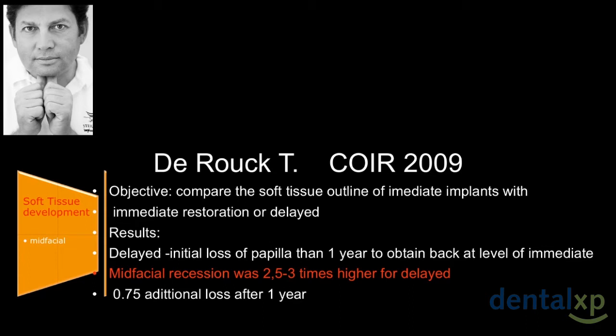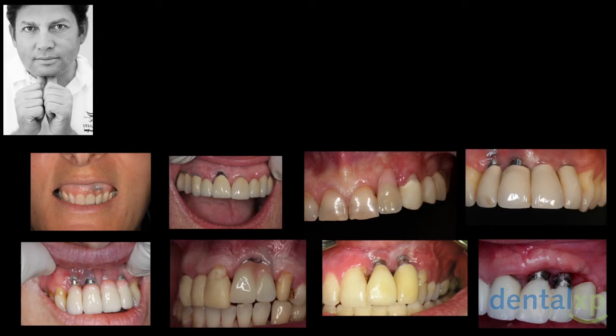So we developed an algorithm for developing these soft tissue techniques. Now, this is what we want to avoid. When we want to restore or repair these cases, how do we know if this is a surgical problem? Let's make a test. Let's look at the second picture from the right, or from your left. Which specialist would you refer this case to? Is it a periodontist? Is it a prosthodontist? It's not an endodontist, that's for sure, but okay?